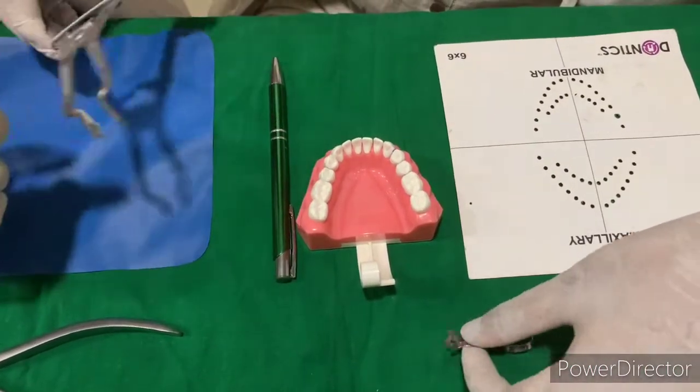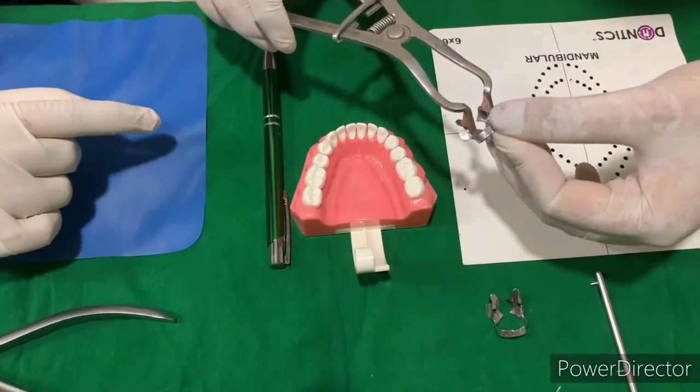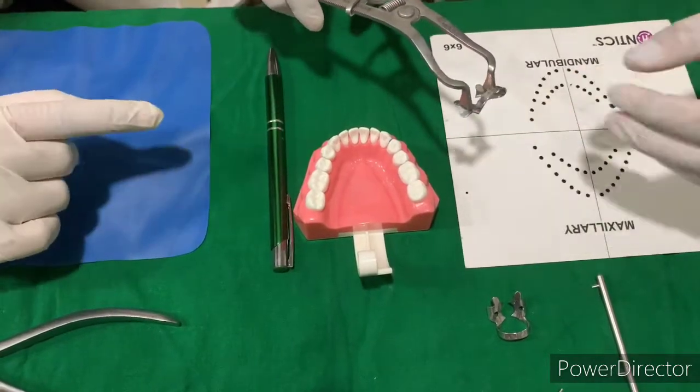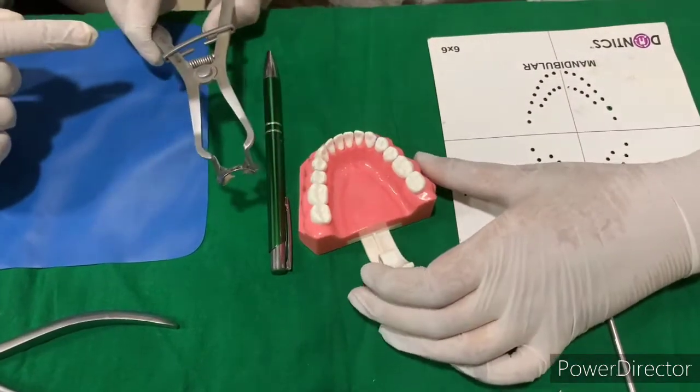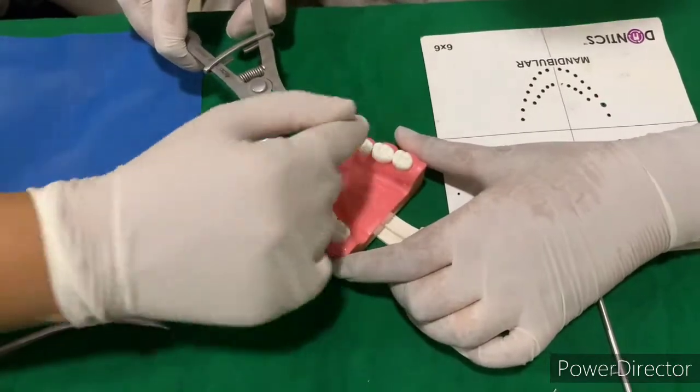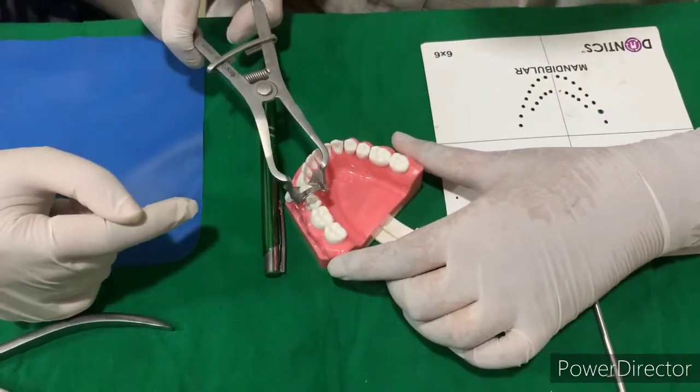This video is about the sectional isolation of anteriors. I'll expose from canine to canine. This is about clamp selection.